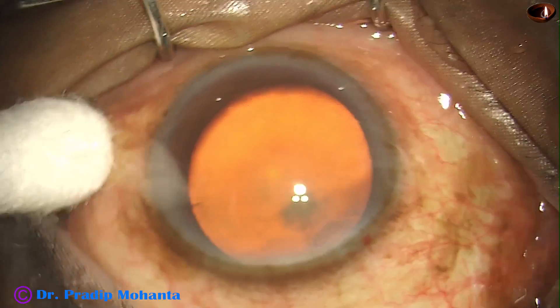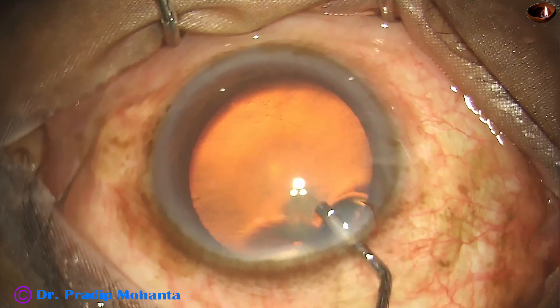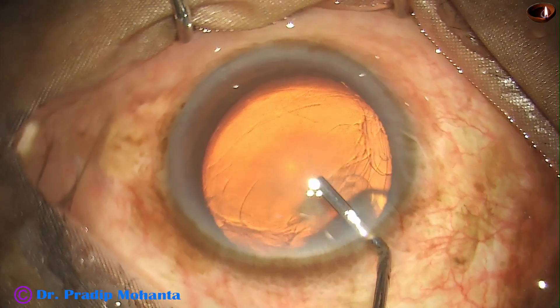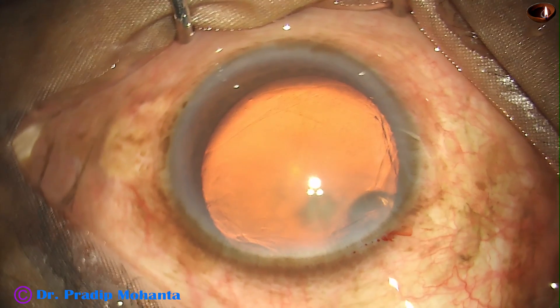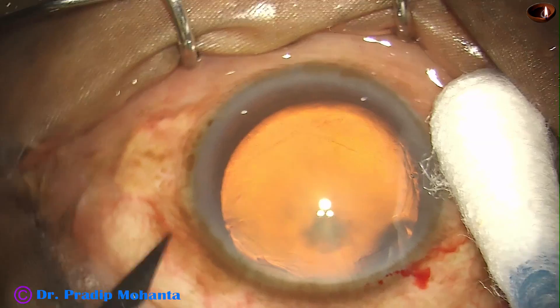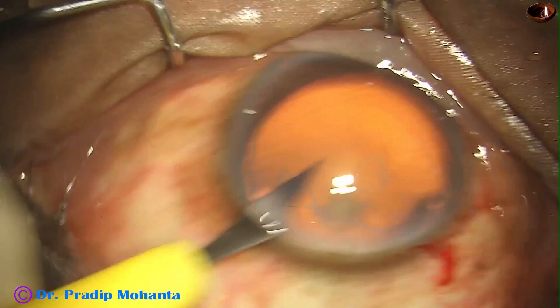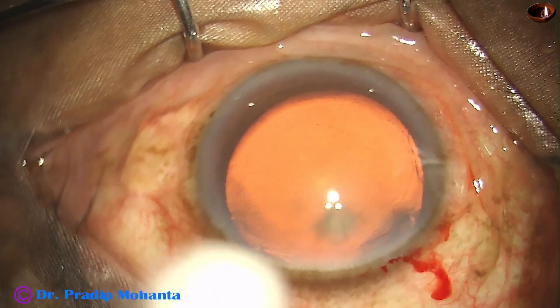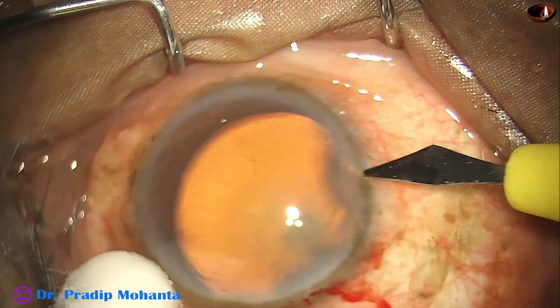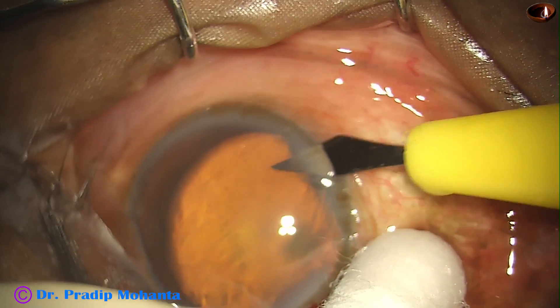This is the main incision on the posterior aspect of the limbus. A 2.8 mm keratome has been used to make the incision. Visco has been injected into the anterior chamber. And now this is a paracentesis on the left side of the main incision, and this is another one on the right side of the main incision.